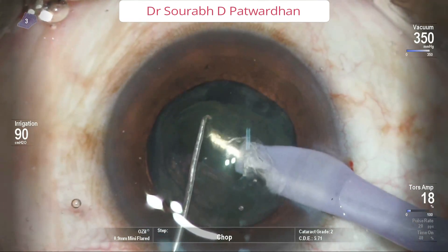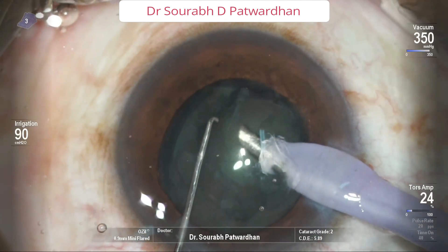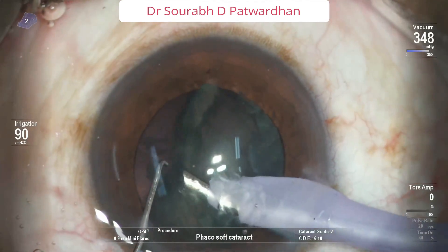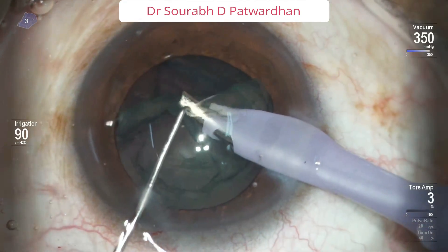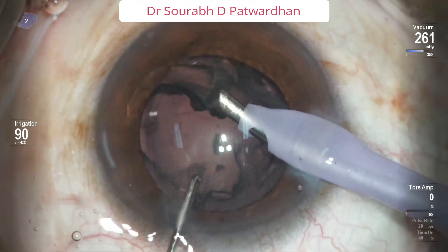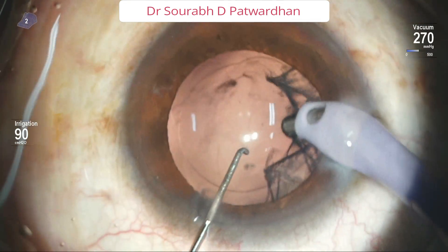I am aspirating at the edge of the nucleus. So when I aspirate at the edge, it starts rotating. Your non-dominant hand can help to feed the nucleus. Keep rotating the nucleus using your non-dominant hand. Always be watchful about the CCC margin — whether your probe is going near to it. Always attack the edge of the nucleus; that's how the cortex, epinucleus, and nucleus tumble out and get aspirated.